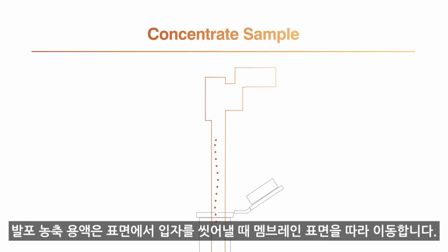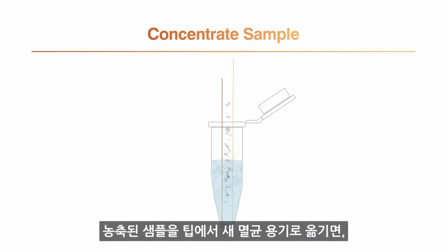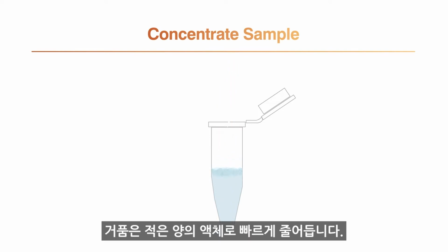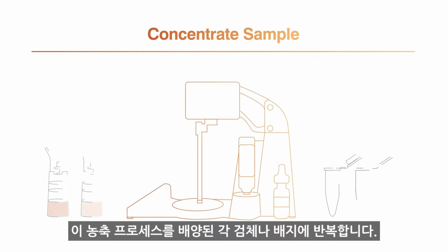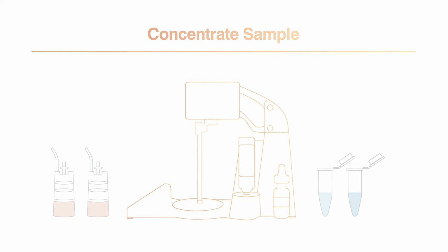The foaming concentrating solution travels tangentially down the surface of the membrane as it washes the particles off its surface. The concentrated sample is then pushed out of the tip into a new sterile container where the foam quickly breaks back down into a small liquid volume. This concentration process is repeated for each incubated sample and media type.